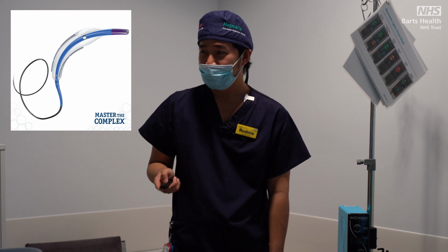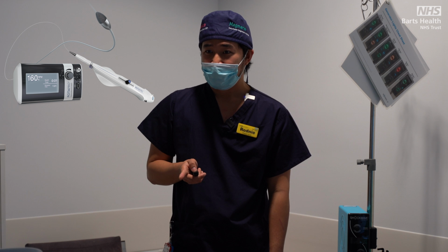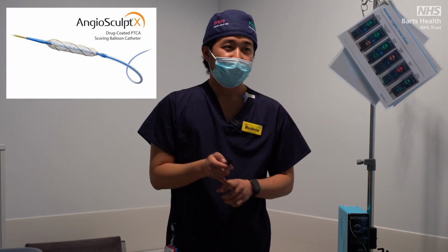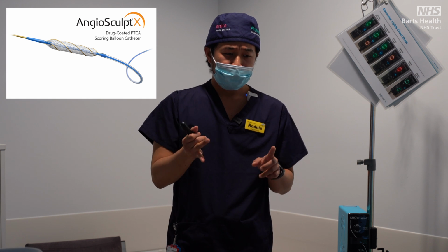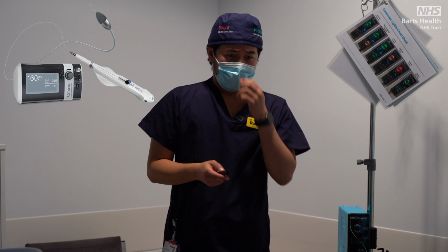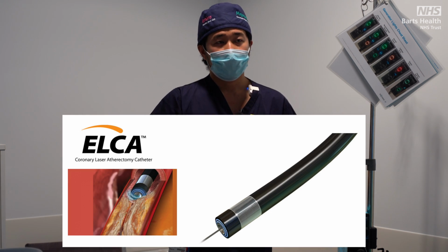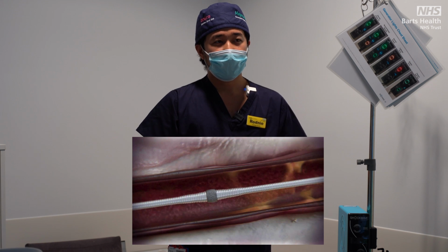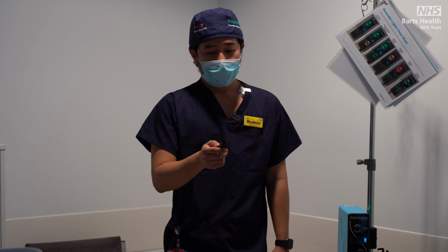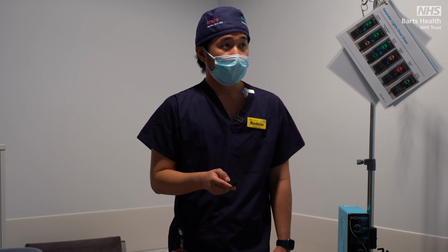Cutting balloons, yeah. Rotablation. Others? Scoring balloon, yeah. So scoring balloons, cutting balloons, high pressure balloons, OPN balloons, rotablation, lasers, rotational atherectomy or rotablation. In some centers, they have orbital atherectomy as well. So I'll explain to you the problem with these technologies.